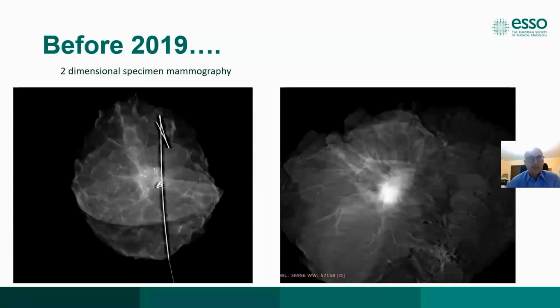And then the technician returned to the operating theater with the plate and description from the radiologist. And he passed the information to the operating surgeon, who ended the procedure or extended the resection margins on this basis. This was a time-consuming procedure, and it required patience of the operating surgeon and also good coordination with the radiologist.